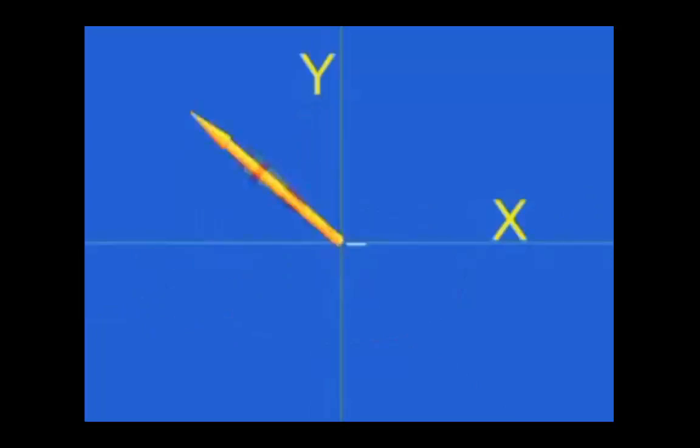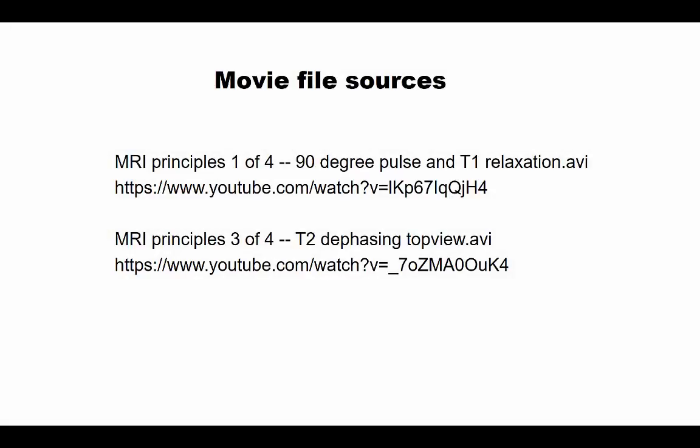If you look at the relaxation from the top view, in the beginning, the XY component is synchronized, with the maximized XY vector in yellow color. Over the relaxation, the XY components are randomized, the vector sum is reduced, and the change can be monitored in terms of T2 relaxation. T2 relaxation is much faster than T1. The randomized XY effect can be easily separated from Z component changes. Could you get a good idea for the T1 and T2 relaxation? I hope so.